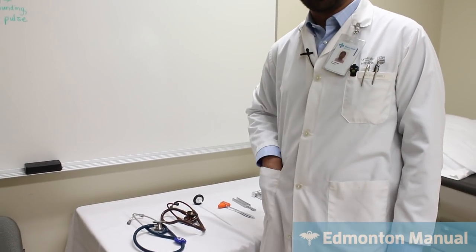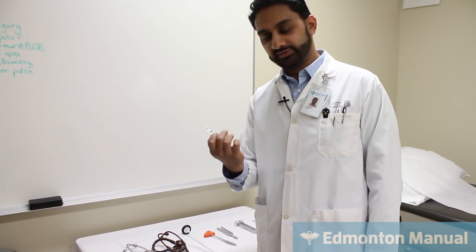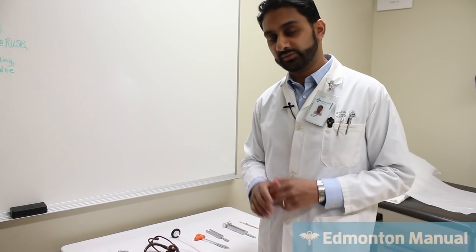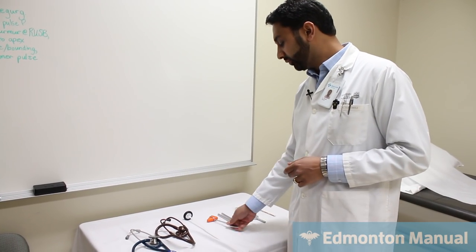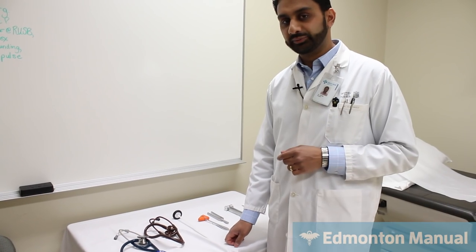What I tend to do in the hospital after every patient is I have just one of these alcohol swabs that I keep a bunch of them in my pocket, and then I clean the head of the stethoscope after every patient. Not something people commonly do, but I think it's something we should get in the habit of. I'll be honest, I don't actually do that as much with my reflex hammer or the tuning forks, but it's probably something that should be cleaned somewhat regularly.